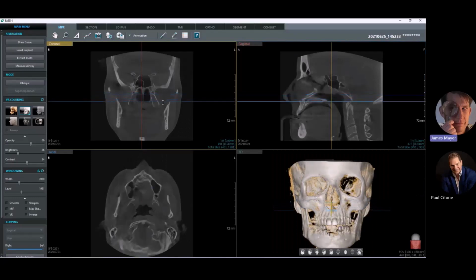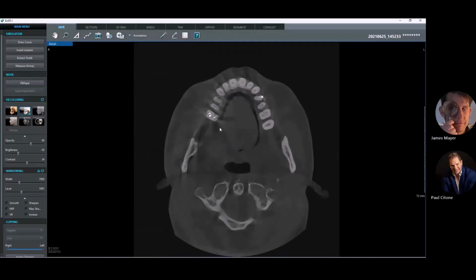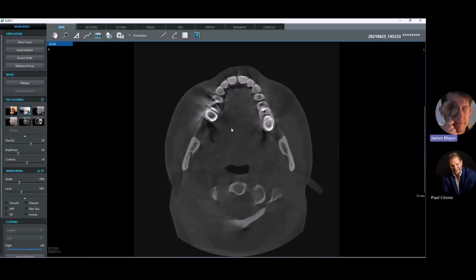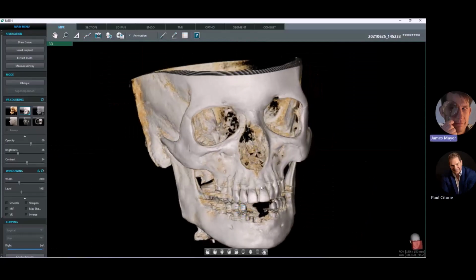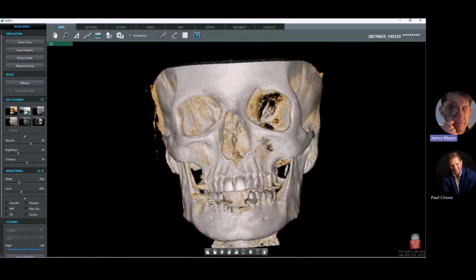And we can scroll back down and let's look at our axial cut here off the gutta percha and our crowns. You see very little streaking effect through there, but that is some of that beam hardening within the data set itself. And that scatter, Jim, is basically the beam bouncing off of the restoration or the implant, creating that streaking. That is correct. Yeah, it cannot pass through. Yeah, so it is a reflection off of there.